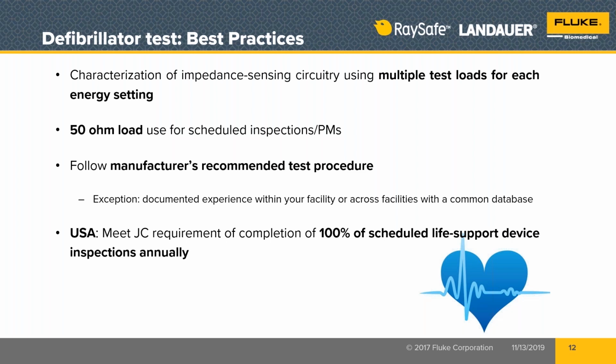We may plot that out as a graph so visually it's easy to understand for the doctor or the nurse. And we'll be able to have a different conversation with them. That conversation will go like this. If I didn't find a failure, then I'm going to show my graph to the doctor or nurse and say, okay, well, I tested this very thoroughly. It shows that it's delivering all its values according to the manufacturer's design. Looks good to me, therefore it must have been something else.